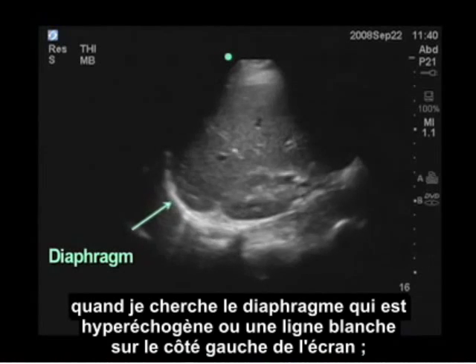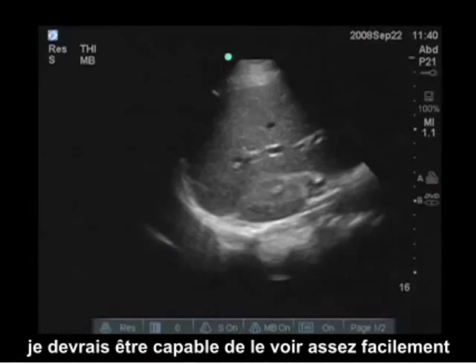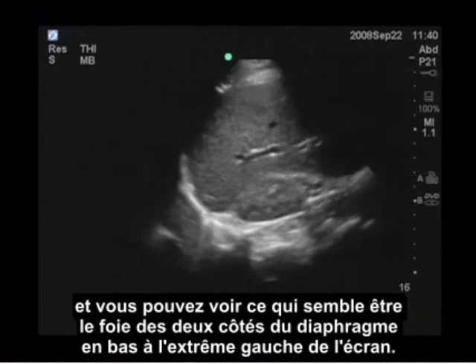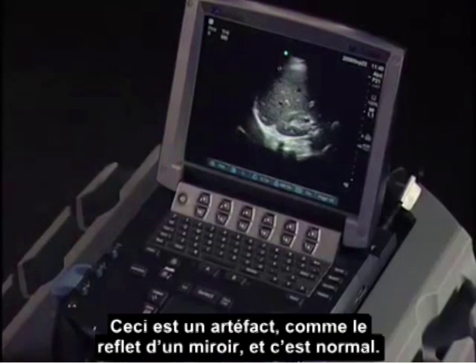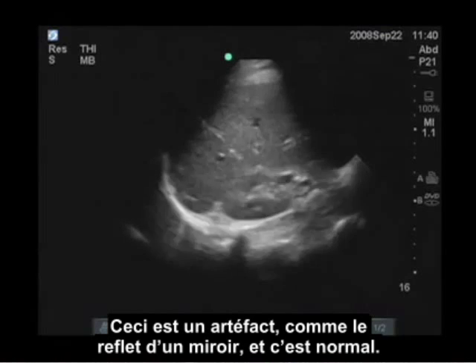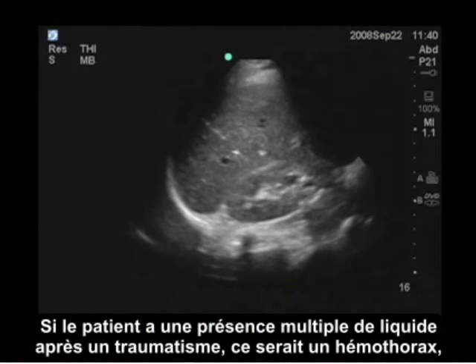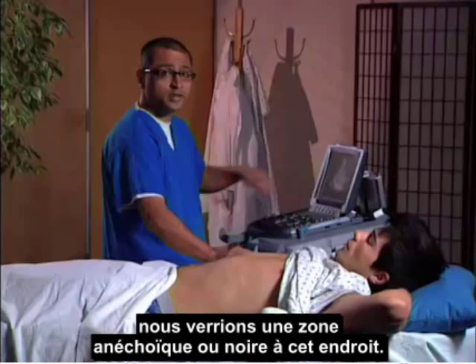I'm also identifying the diaphragm. When I look at the diaphragm, this is the hyperechoic or white line to the left side of the screen. You can see what appears to be liver on both sides of the diaphragm on the bottom far left of the screen — that is mirror artifact and is a normal finding. If the patient had a pleural fluid collection after trauma, that would be a hemothorax, and we would see an anechoic or black area in this location.